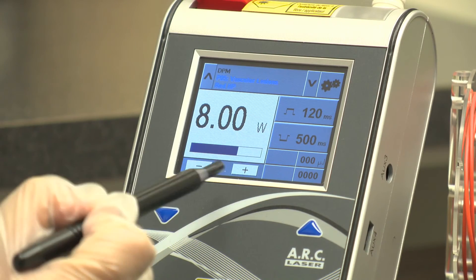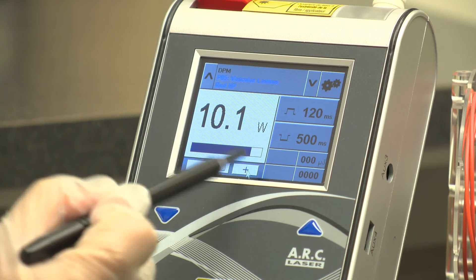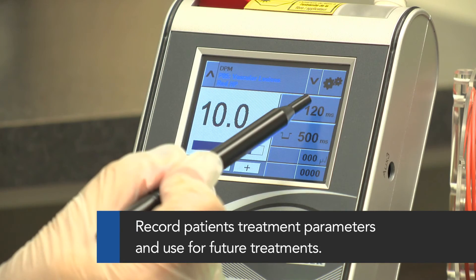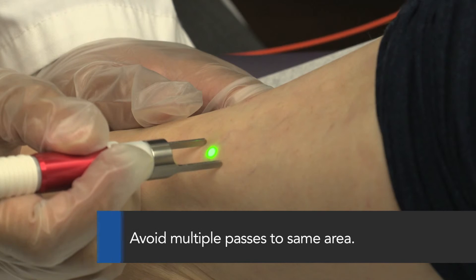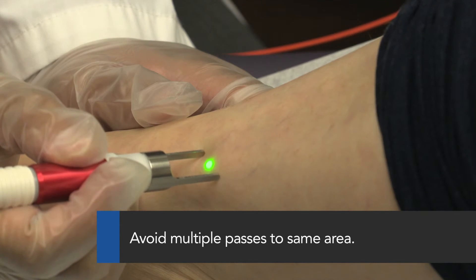Adjust the parameters as long as the skin allows it. Make sure to record the patient's parameters for future treatments. Avoid multiple passes on the same area in one treatment.